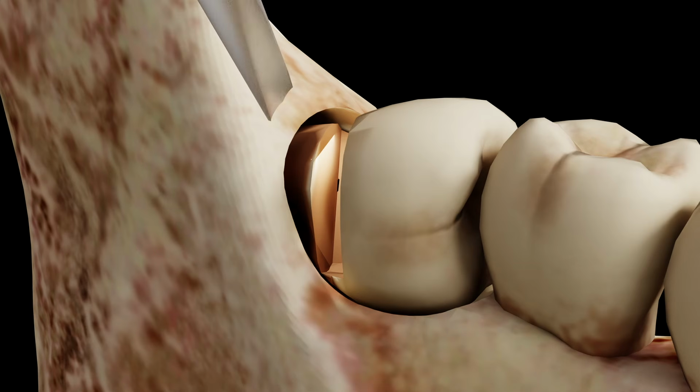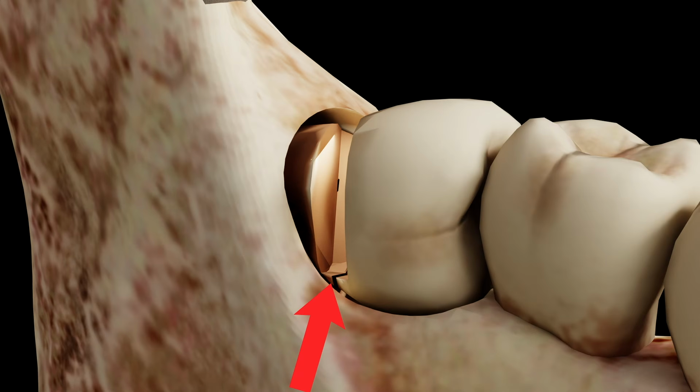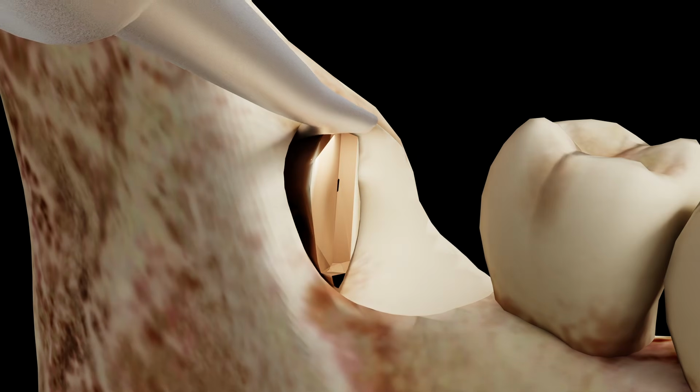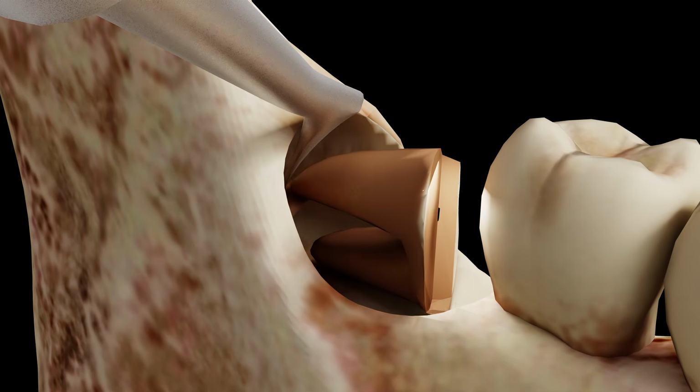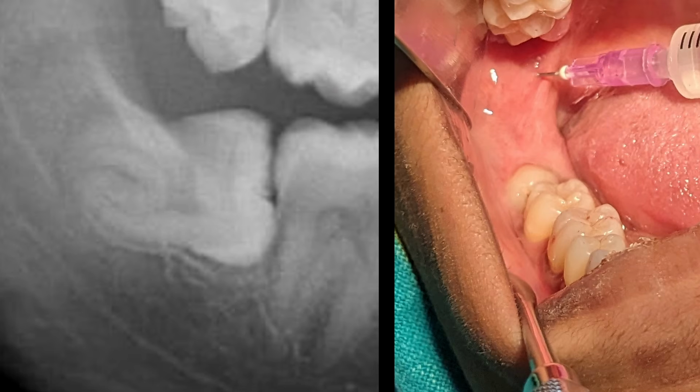I place the coupland elevator inside the section and rotate it. This fractures the section and separates the crown and root. The crown is then removed from the socket. To remove the roots, I place a Cryer elevator inside the distal gutter and push the roots out of the socket. So that's how I am going to remove this horizontally impacted third molar.